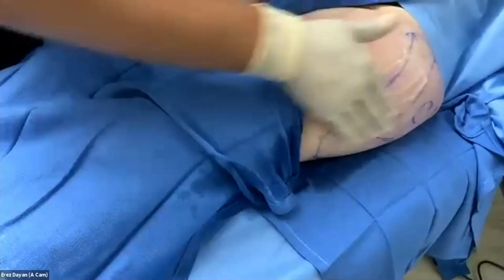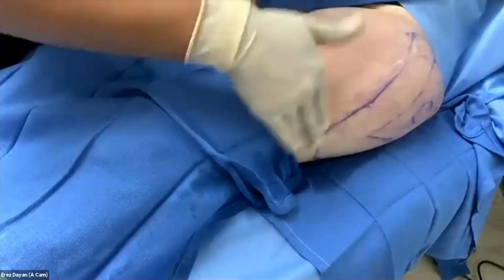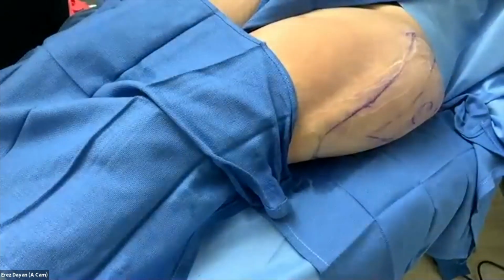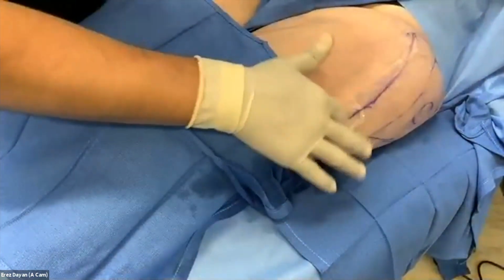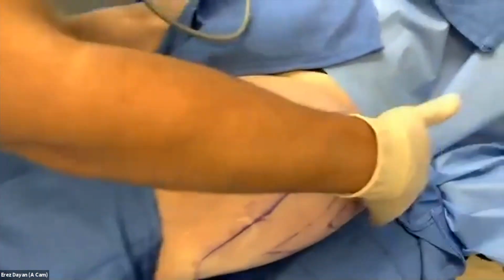So we put some water-soluble ultrasound gel. You really shouldn't replace this with bacitracin or anything else. You'll get a burn. You may wonder how I know that. No, that wasn't you. So we just put a generous amount of gel on here. It helps with the conductivity.